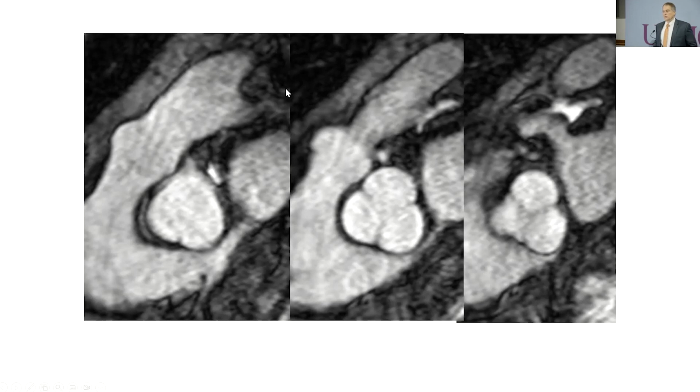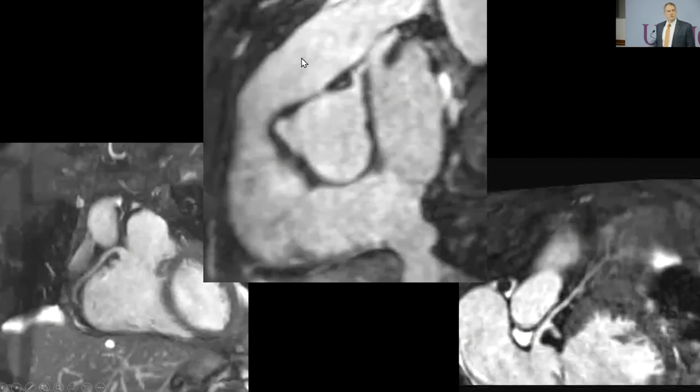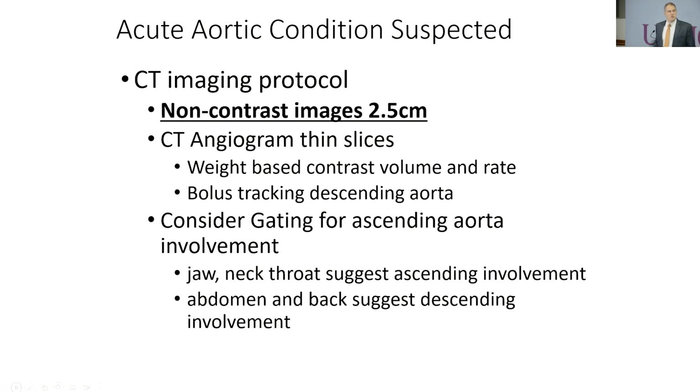And again, there's always some minute difference between CT and MRI in terms of potentially the phase, so you have to be careful in comparing studies longitudinally in terms of drawing too much conclusion, but from one study to the next, there's good reproducibility. And the anatomic resolution is really pretty good with these studies. You can see the coronary arteries. It's not necessarily good for reading the coronaries for stenosis, but just in terms of the actual definition of what's going on. I'll talk about acute aorta.